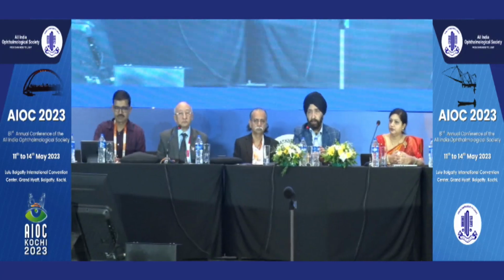So I think what he has highlighted is that the preoperative ocular surface is important. Biometry being bang on is important, and obviously psychology, which he has talked about, and where the IOL centers is also important. But I think with the present generation of trifocal lenses, the incidence of adaptability and neuroadaptation has gone up very significantly. The complaints have gone down, and whatever technology they have used to smoothen out the ridges that are there, I think that has helped significantly.